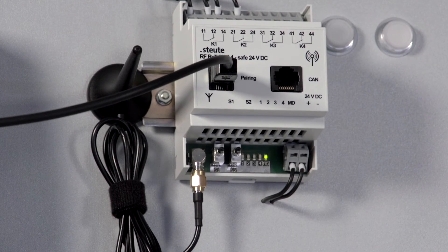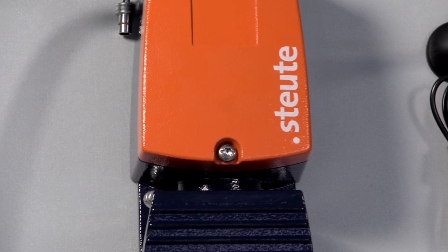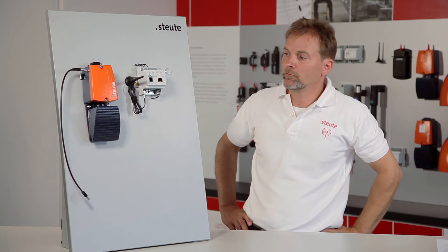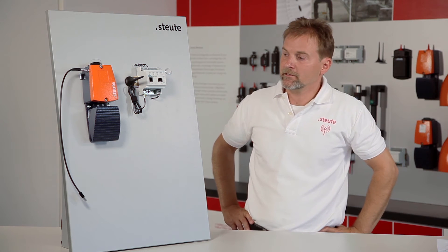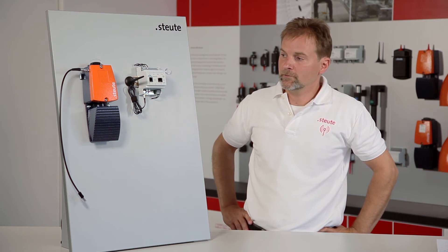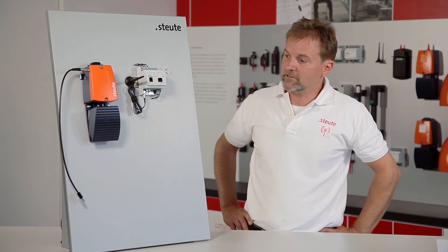The wireless foot control can now communicate with the wireless receiver. The wireless foot control and the wireless receiver are now connected through the one-off pairing procedure, and the two components can communicate with each other from now on.